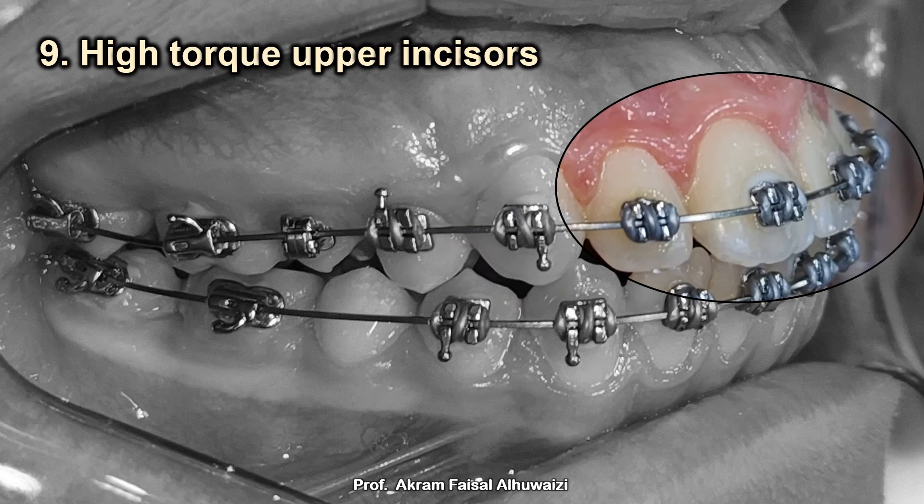Tip number nine: use high-torque upper incisor brackets. As we retract the upper incisors backwards, we get lingual tipping, which is not wanted — we want them to remain relatively upright or slightly proclined. This means we should use high-torque brackets, which in the MBT system means plus 10 for the lateral incisor and plus 17 for the central incisor. I would not favor Roth brackets here; MBT ones are fine.